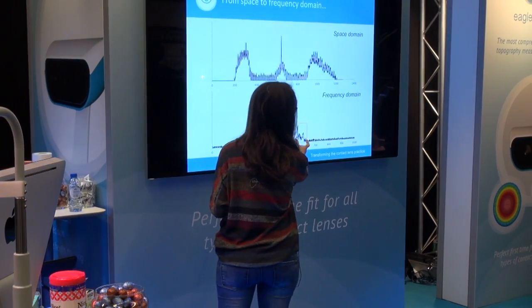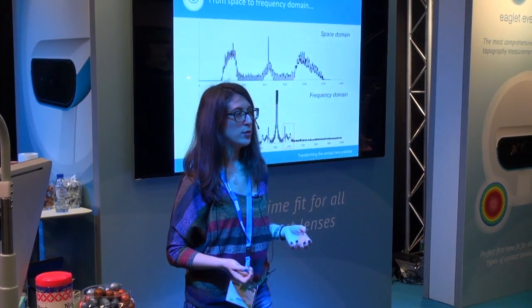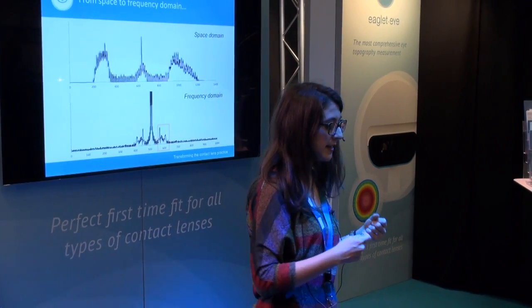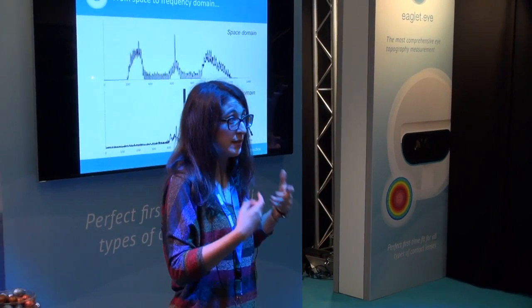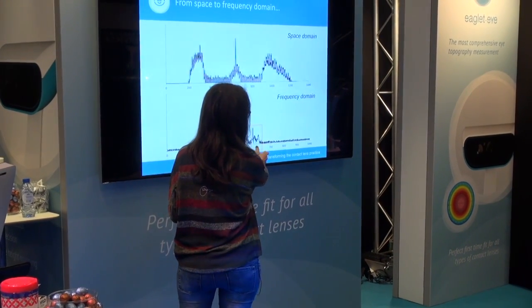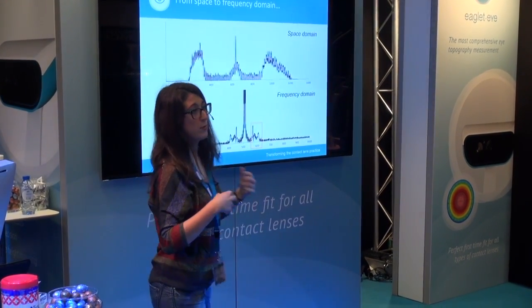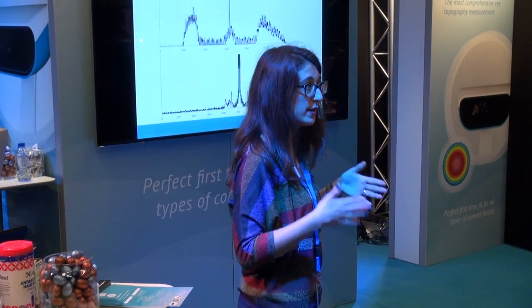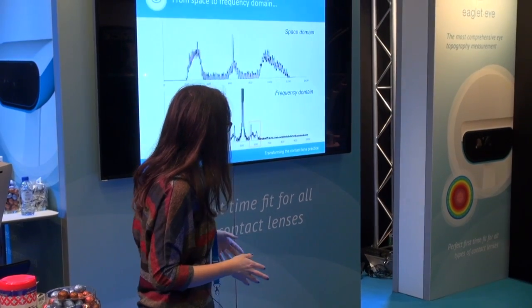Here is where the carrier frequency is. The carrier frequency is the frequency that really has the information that we need. Selecting this box here is the most tricky part of the whole process: knowing exactly where the information is.